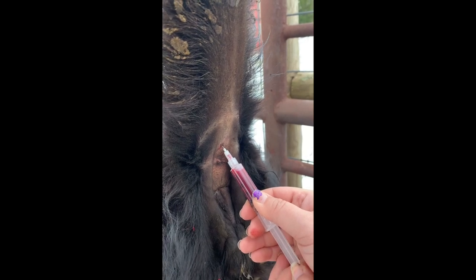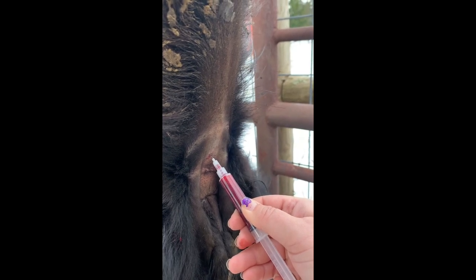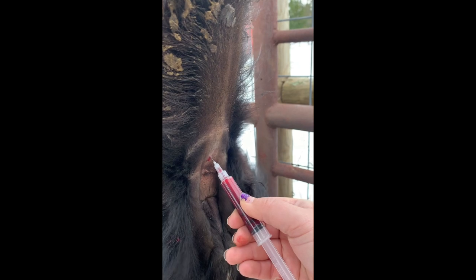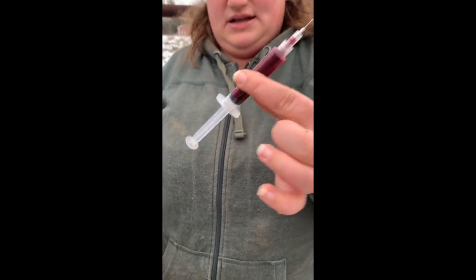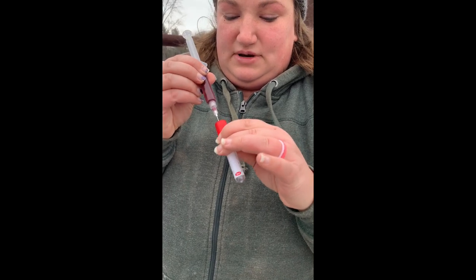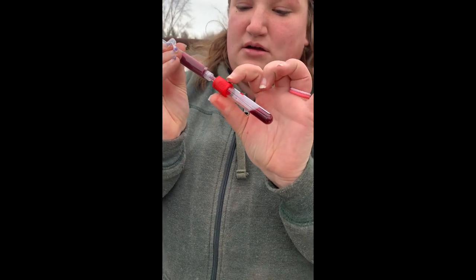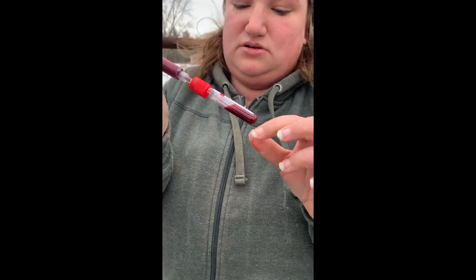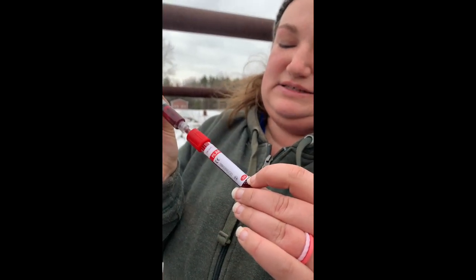I'm just going to pull in the blood. You need about two cc's — I'm going to get a little extra. Pull it out. You could apply pressure but she's barely bleeding so I'm not worried about it. I've got my blood in my syringe. The way I do it is just hook it into the vacutainer, and the suction will start pulling it out itself, but you can help it too. This is a three milliliter or three cc tube and you need at least two cc's.